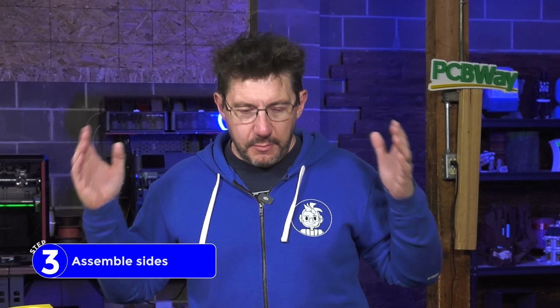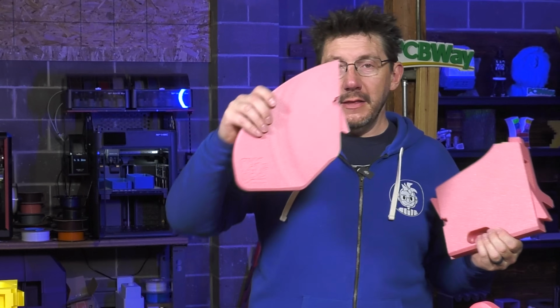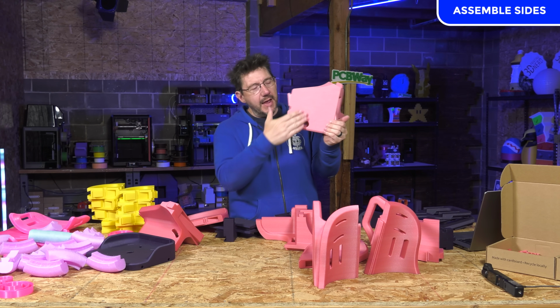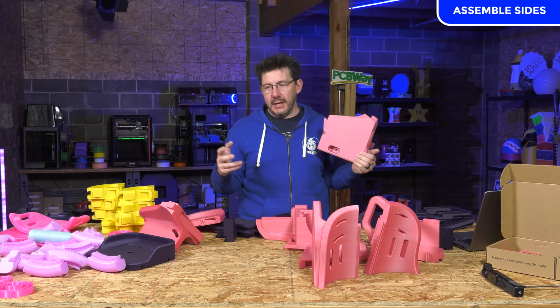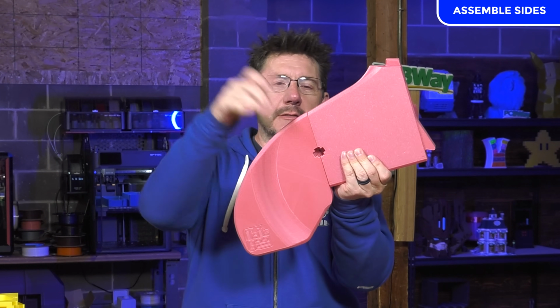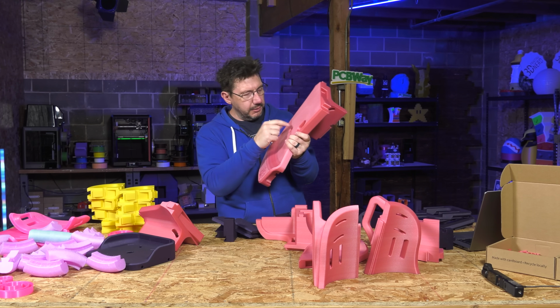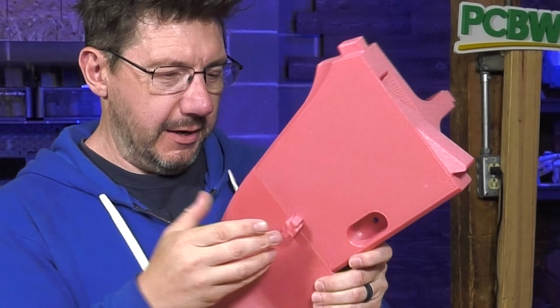The first thing that you want to do is put together the sides of the mobility trainer, and this is the inside of the mobility trainer. This piece where you can see the MakeGood design shares the same face as this, because right here is a little assistive piece for one of the axles. And so you want to make sure it's on the outside. So you can put this into here and just like that. And see, it's got a little section to put a widget in to hold it into place, about that tall. And it's going to go in right there.